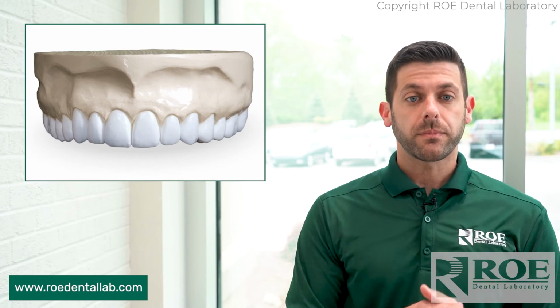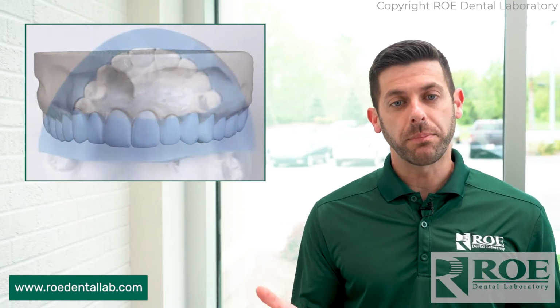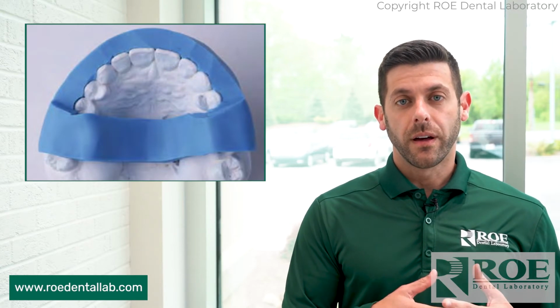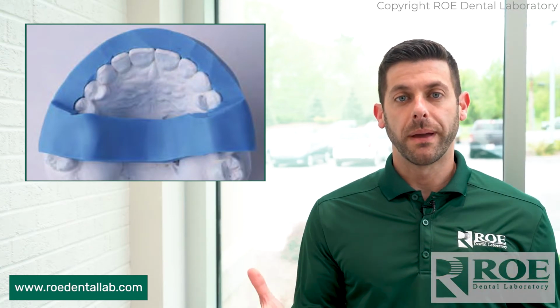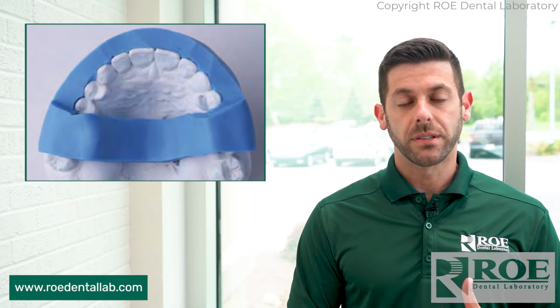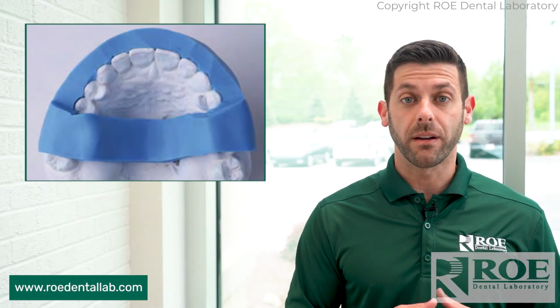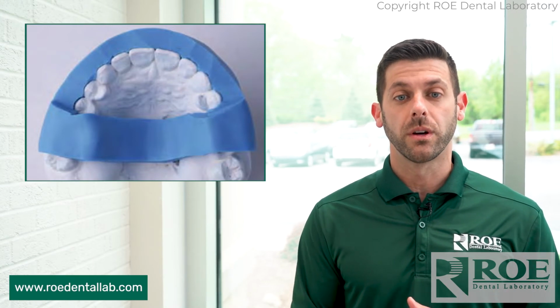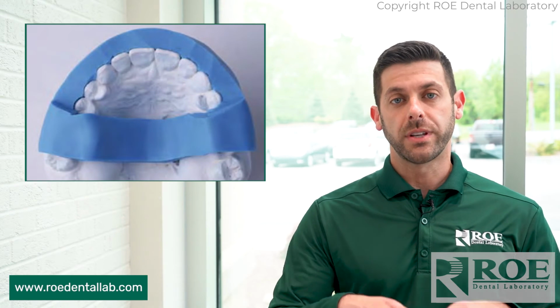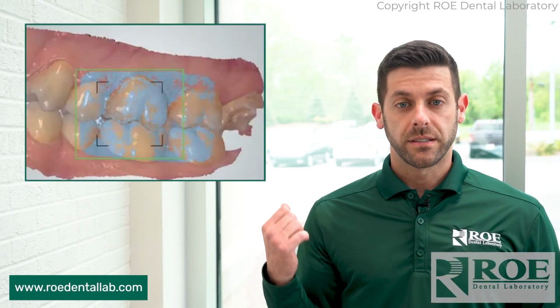From there, we are going to send you a prep guide and a temporary matrix as well. So again, another way to kind of help make sure these are all accurate, a very nice prep guide. And if you want to make temps, you can do that yourself, but we can also make a very nice temp matrix for you. Once that is completed, teeth are prepped, you'll take another impression, send that over to the lab.